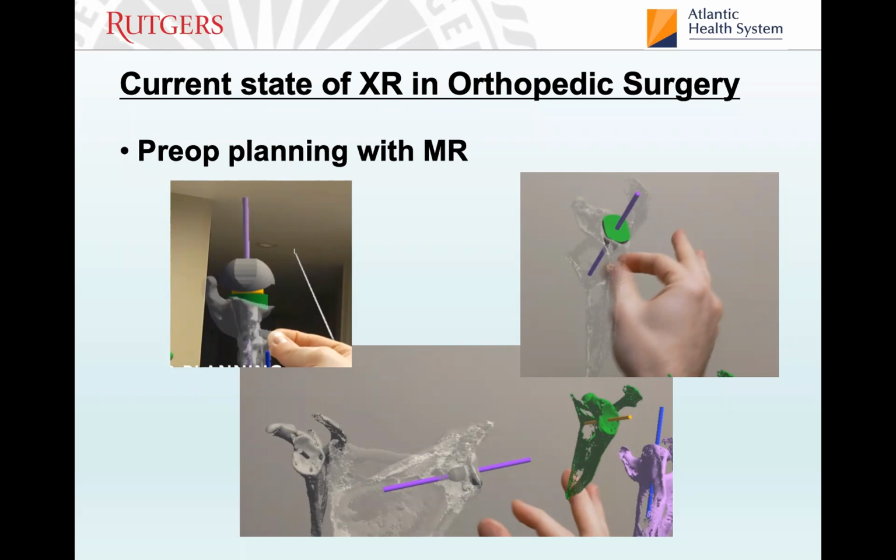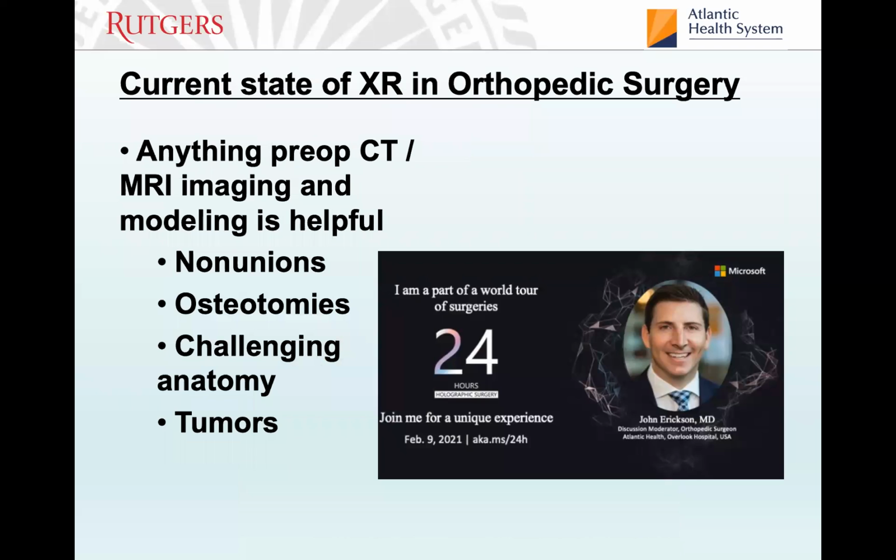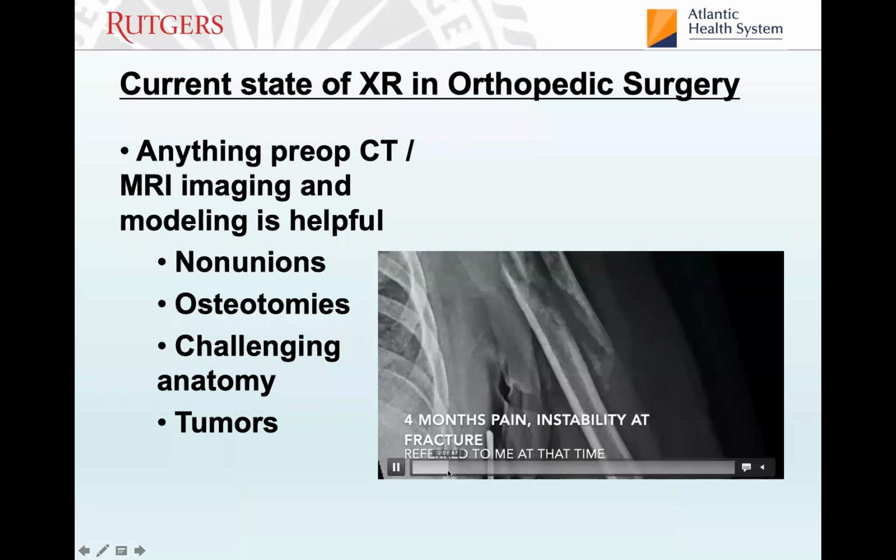But I think because of the market and how this stuff has developed in general, unless you're developing yourself, implant companies obviously have a vested interest in you. They want to sell you implants. So their apps, their machines, their programs are tailored to very specific interests. But on the whole, extended reality options are a tool that you can use for lots of things.